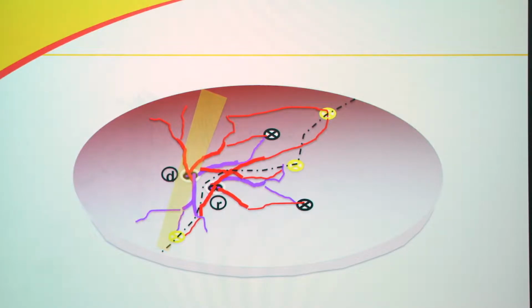And the vascular equator is something like this. What we define in our technique is to start at one edge of the placenta, find every anastomosis, and burn them until the center of the cord insertions. So about 1.5 centimeters away from the cord on both sides, we stop and then go to the opposite side.